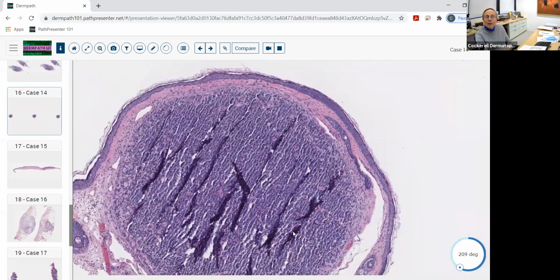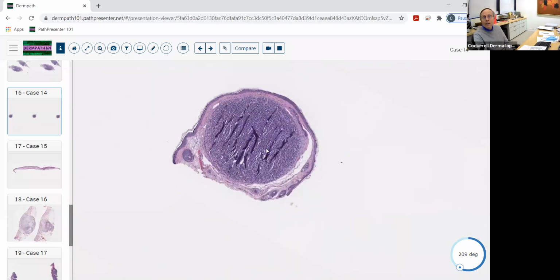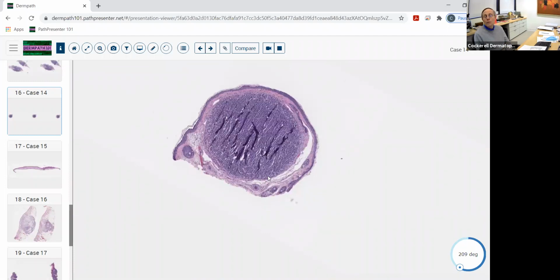And again, the difference here is that usually you've got these individual small aggregations. Usually there's two or three of them, or even more than that in the dermis, but you don't really have all the little small aggregations that are put together in a way, kind of like a jigsaw puzzle, like you see with a cylindroma. So a lot of these you'll see a combination. You'll see areas where there are classic larger blue balls in the dermis, and then you'll see smaller areas where there are the more small aggregations with the pink hyaline cylinders surrounding them. So you'll see those together. And when you see that, again, think of the Brooke-Spiegler syndrome in that situation.